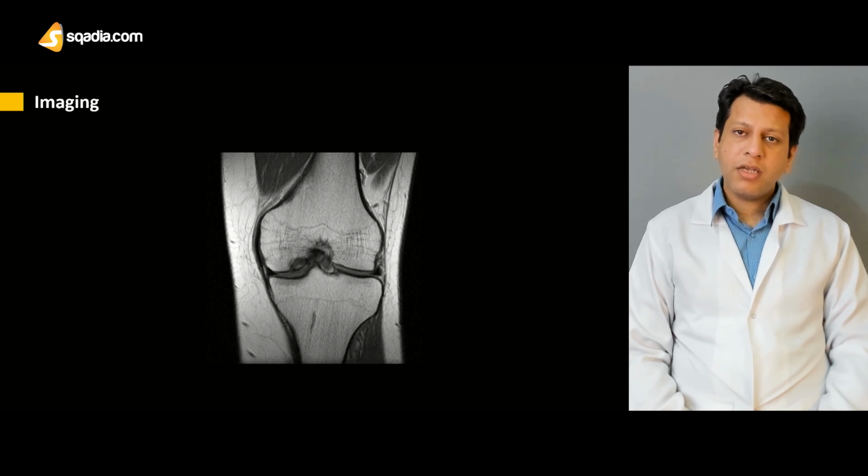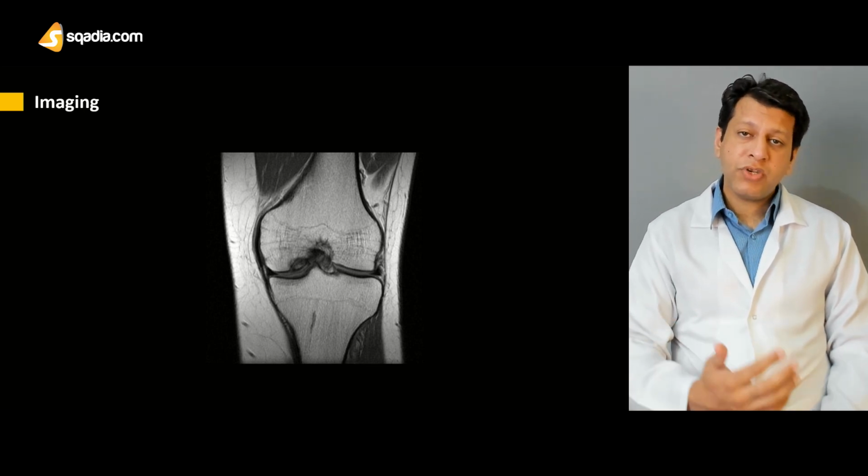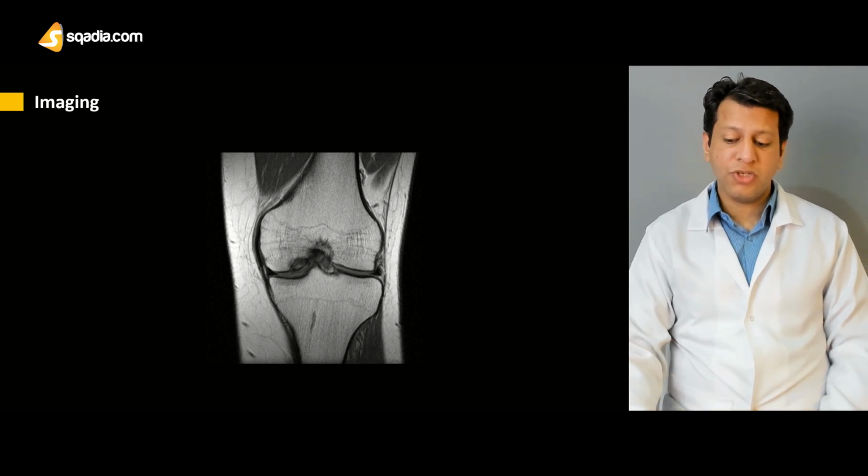But actually MRI is important to check the stability of the lesion. If it appears to be a stable lesion, our treatment may be very different, but if it's an unstable lesion, our treatment may vary greatly as well.